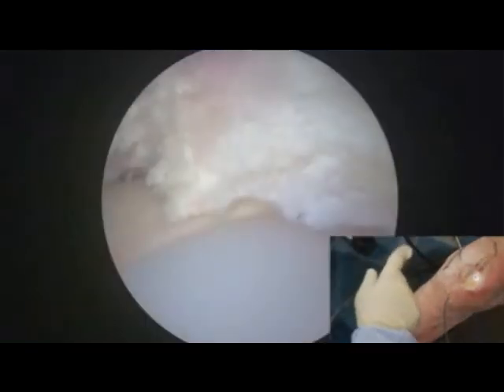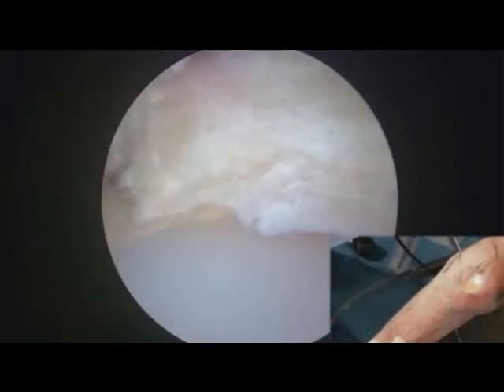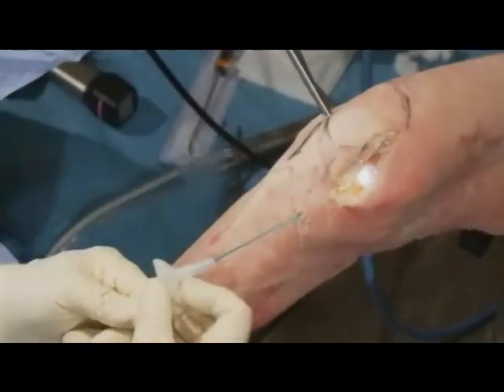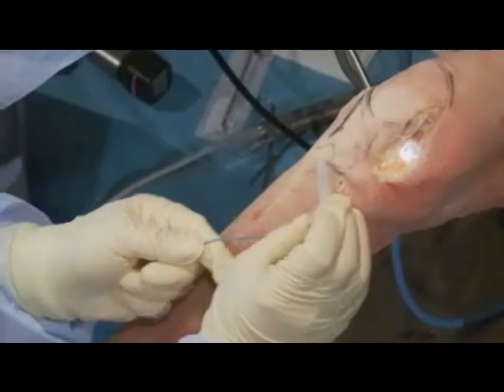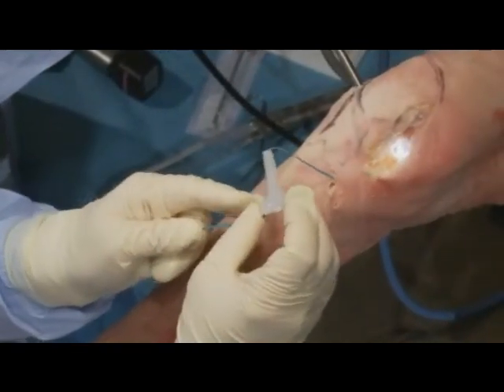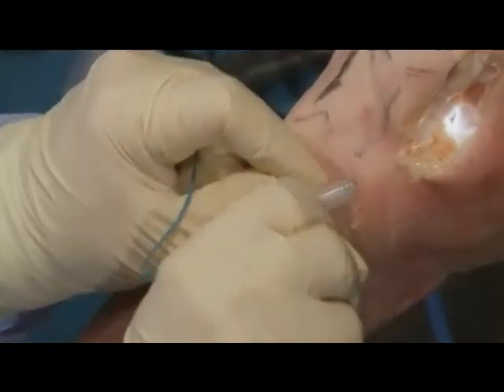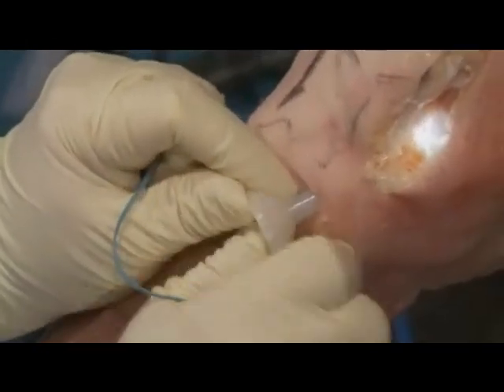Okay. And then we have a plastic cannulated portion. Could you just hold the scope, please? You can go to the all outside shot at this point. So you see I have this device here which is also threaded. I don't know if you can see the threads. What we do is slide that up the sutures. We find the hole, and this gets turned up the hole.